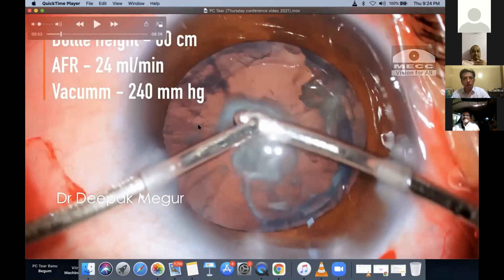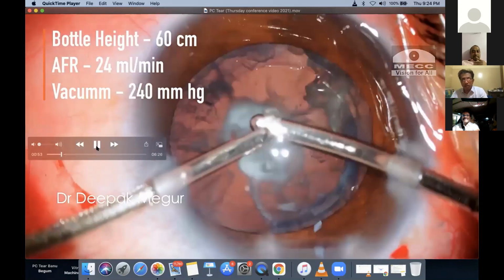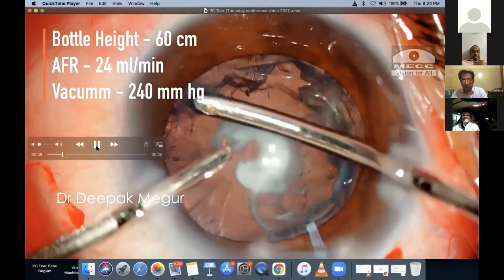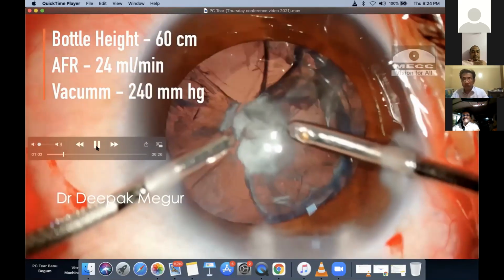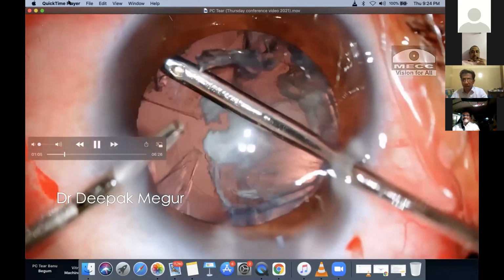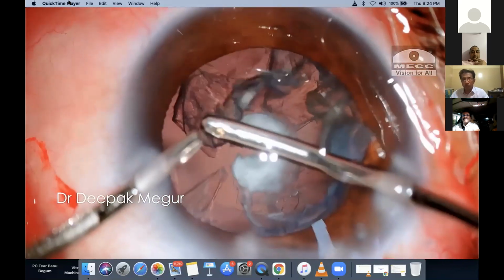And one trick which I always use is to lower the bottle height. The bottle height which I'm using is 60 centimeters, contrary to the one which we regularly use, around 90 to 100 centimeters. So you are going slow, and to compensate for that, I'm also using less flow rate and less vacuum. I don't want the chamber to shallow, but also I don't want it to suddenly deepen, especially in young patients who have this elastic sclera, and the eye has a great tendency to suddenly deepen and also shallow.